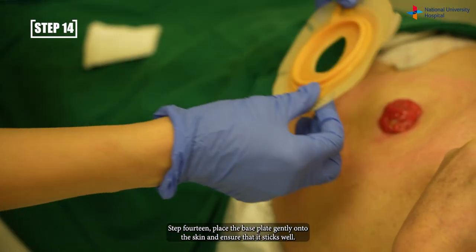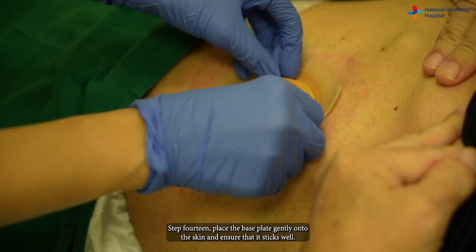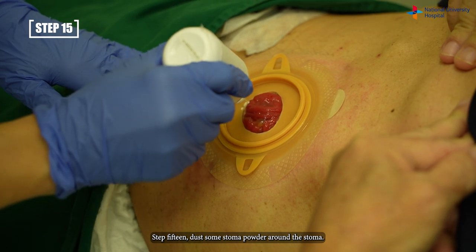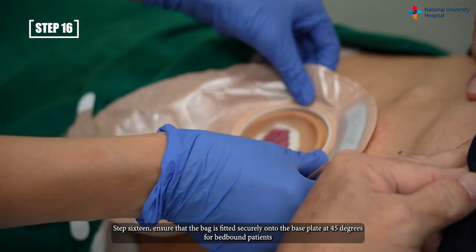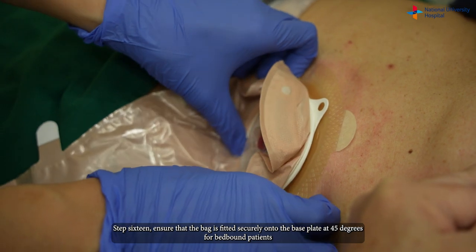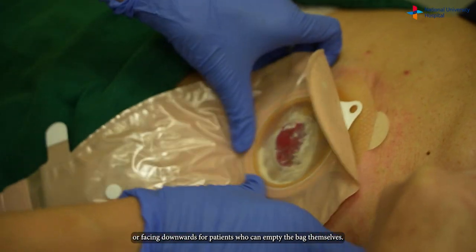Step fourteen: place the base plate gently onto the skin and ensure that it sticks well. Step fifteen: dust some stoma powder around the stoma. Step sixteen: ensure that the bag is fitted securely onto the base plate at 45 degrees for bed-bound patients, or facing downwards for patients who can empty the bag themselves.